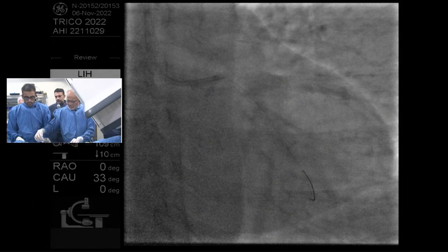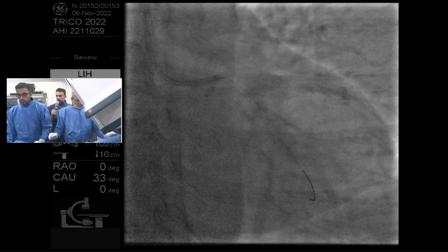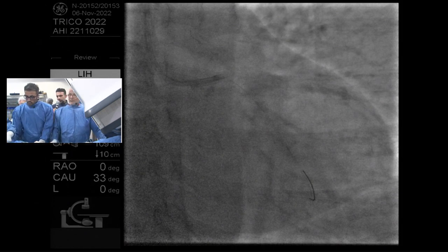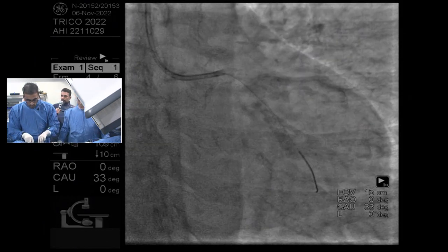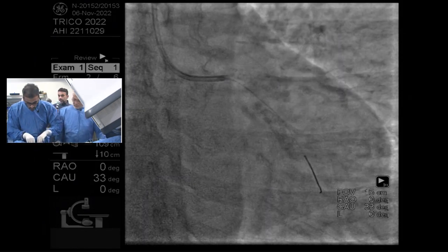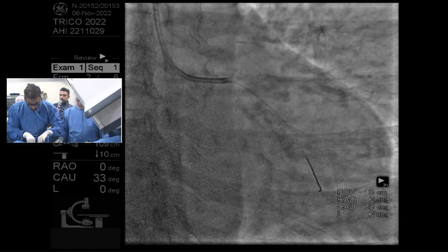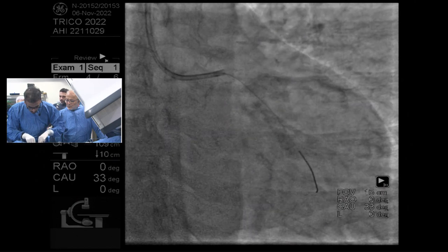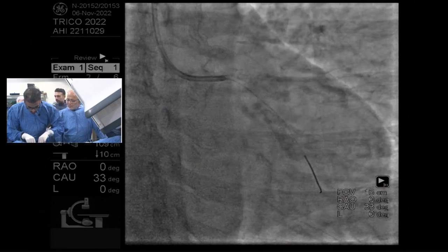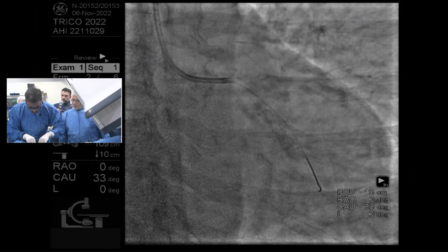Is there any difference between your IVUS, the wire in the circumflex to the left main, or the LAD to the left main? That's a good question. The key is if there's an eccentric left main, then the key is to disengage the guide catheter enough, but keep it coaxial so that your image is straight. If your left main is very, very short, then the answer is yes. And typically I will IVUS on both of them because you get slightly different views. But it's pretty obvious most of the time if there is very little or no plaque at the ostium of the left main on the IVUS that you don't need to do both vessels.